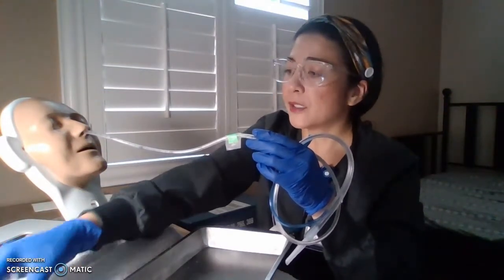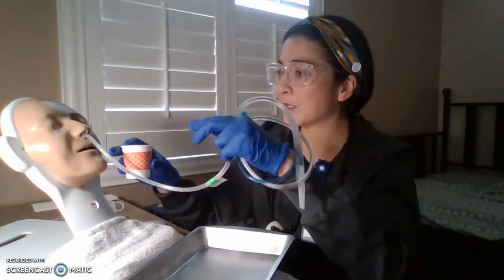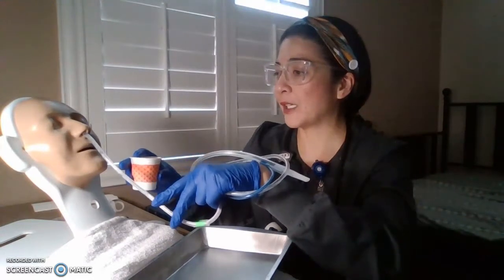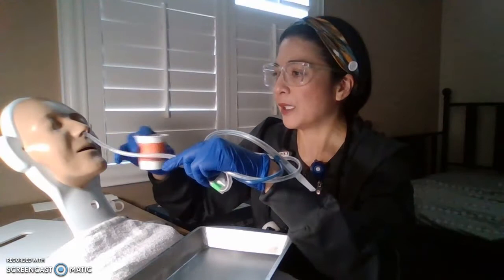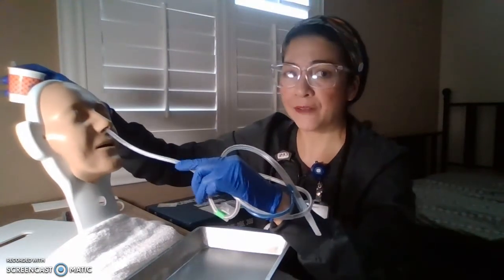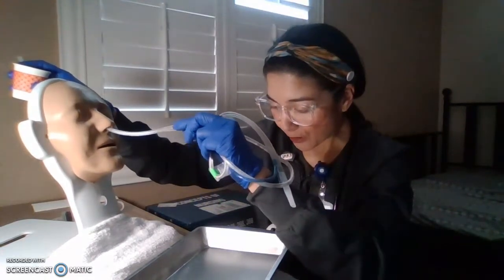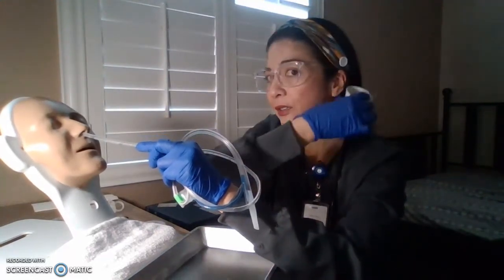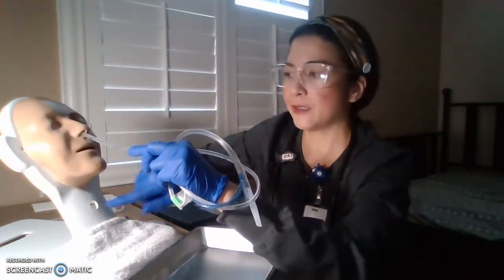And then at this moment, if they do start gagging, you can stop. And Mr. Sunny, I would have to ask you to drink some water, small sips, while I insert the tube to help it go down easier. Okay? So while you are doing that, you can have somebody help you with this. He's sipping and you are inserting. And at the same time, you can have him hyperflex the neck just to help the tube go down easier through that curve right here. Okay? Through this curve. All right.